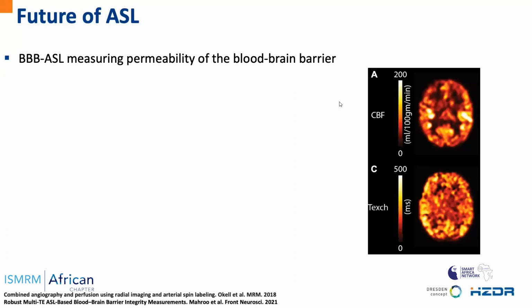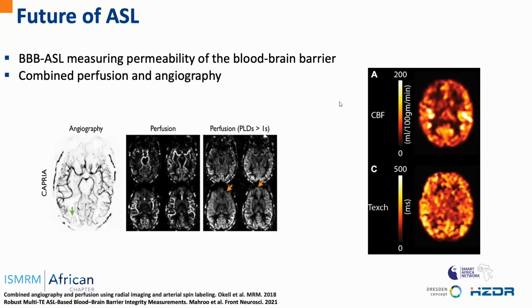And as another very promising technique, I would like to mention the combined perfusion measurement and angiography. So with a single measurement, you can obtain the perfusion maps, but also high-resolution, time-resolved angiography of the brain.